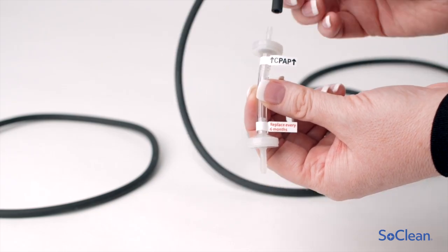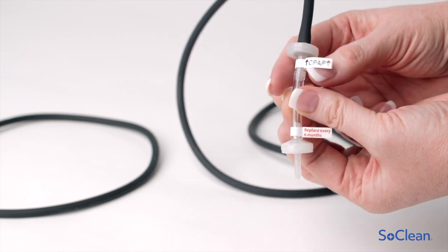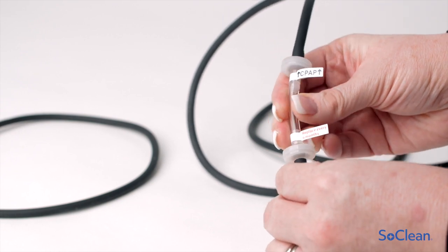Grasp the barrel and insert the stem as far as possible into the end of the tubing. The tubing should be nearly touching the barrel of the check valve. Repeat for the remaining side of the check valve.